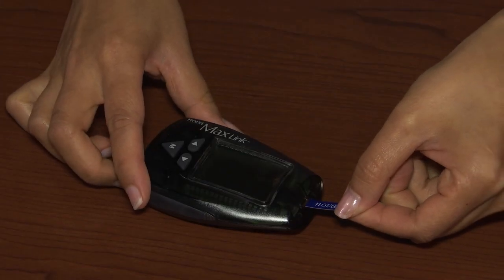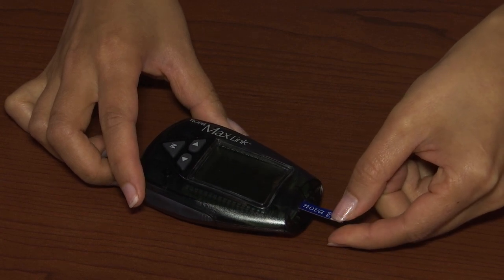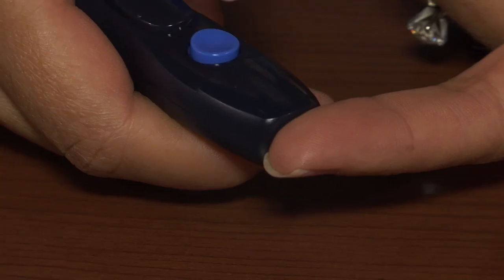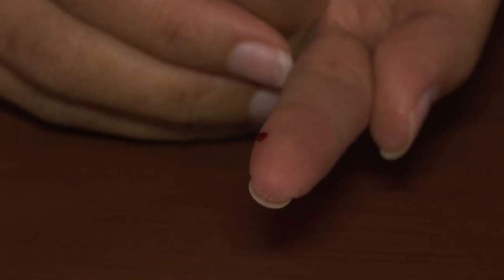Grasp the strip on each side between your thumb and index finger so that the black strips are facing upward. Insert the test strip into the meter and push the strip in until it will not advance any further. The monitor will turn on automatically. Follow the same procedure used to obtain a drop of blood for blood glucose testing.